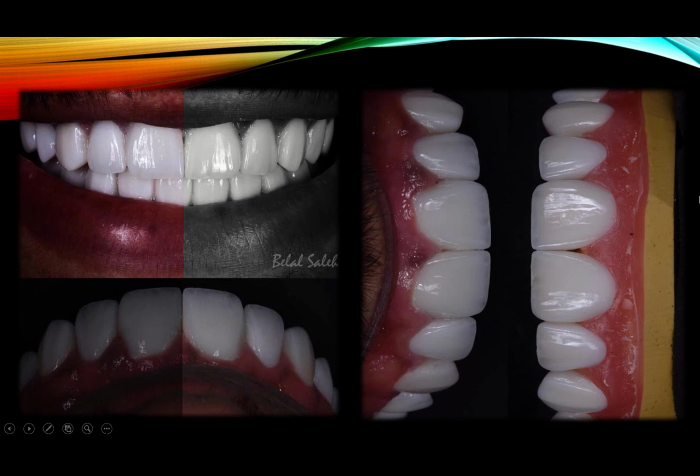All right. The same thing. Why would you layer on a cervical that you cannot? In most of our work here, we don't put, call it a neck or a buccal neck here. You know, this elevation here, and then you go towards the inside, the lingual, as you build up. You don't do that. Most of the shape that's adapted here and people like is straight shape. So we don't have a neck.